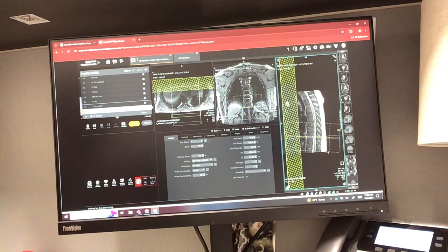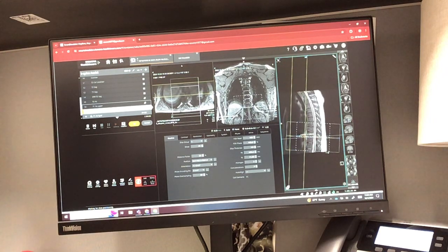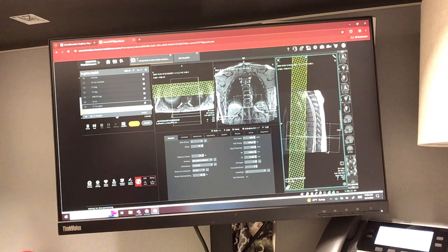I'm gonna bring in this anterior rest slab or pre-saturation band. Okay, I know before in my upper I covered T1, 2, 3, 4, 5, 6, 7, and I was all the way down here in the bottom of 8. And so 9, 10, 11, 12. So I have all of them covered, and I'm angling with these disc spaces down here posteriorly.